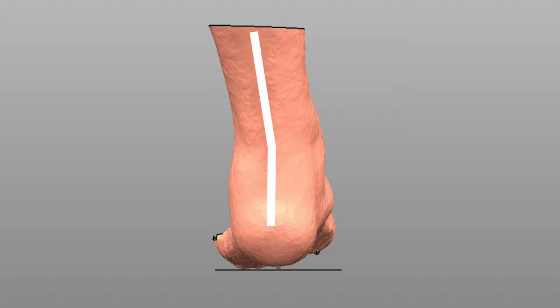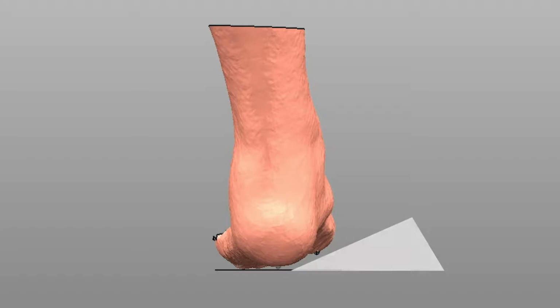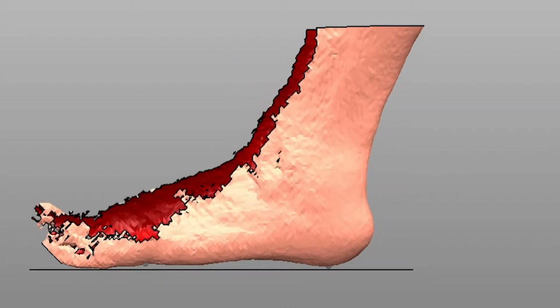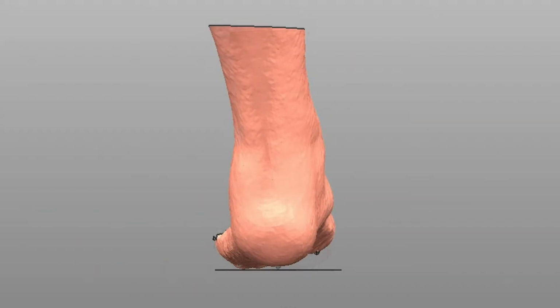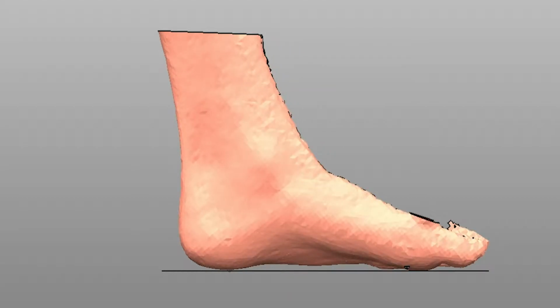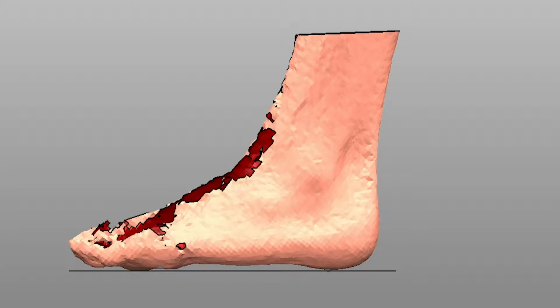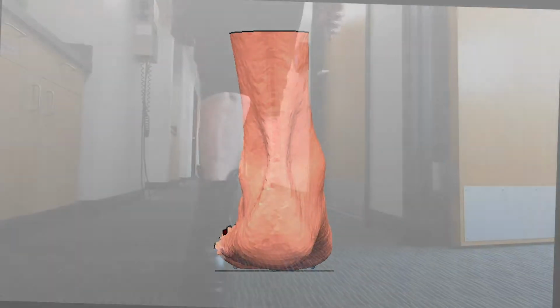Here is an example of a digital cast which has not been adequately corrected. The scan shows a high degree of forefoot supination deformity, which will make it impossible for the brace to correct alignment for this patient. Here is another cast where the forefoot deformity and the rear foot deformity have been corrected, and this allows the Richie Brace to maintain correction, maintain alignment, and achieve a positive patient outcome.